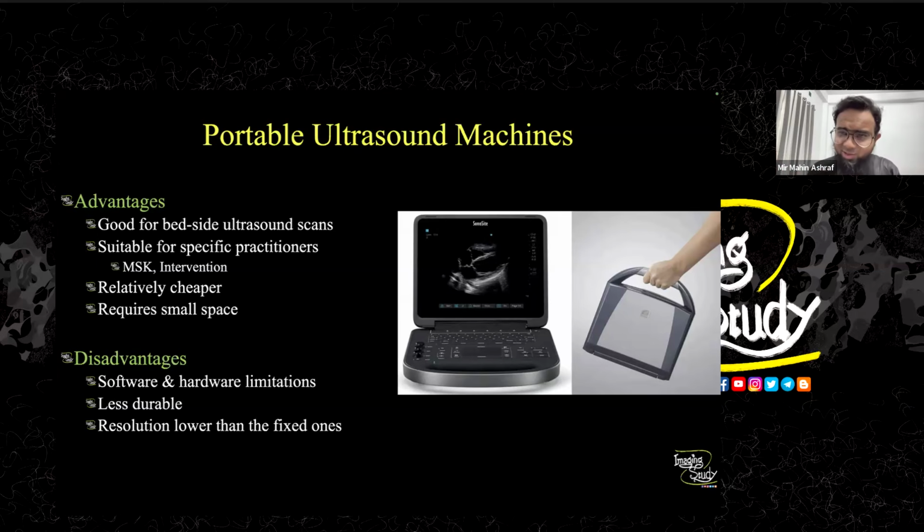And when we look at our ultrasound machines, manufacturers are giving us like 512 megabyte of RAM or 1 gigabyte of RAM if you are very premium person. So this is very weird. You should give very high RAM. You are taking very big money, so that happens for the large machines also, and for the portable ones.